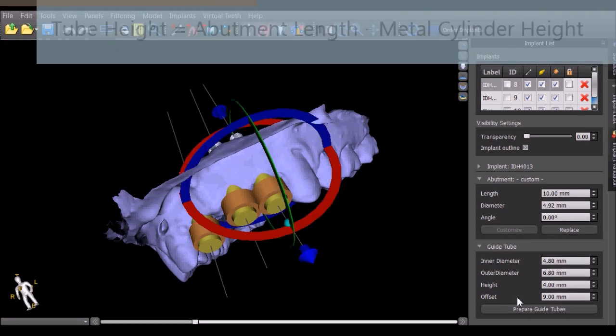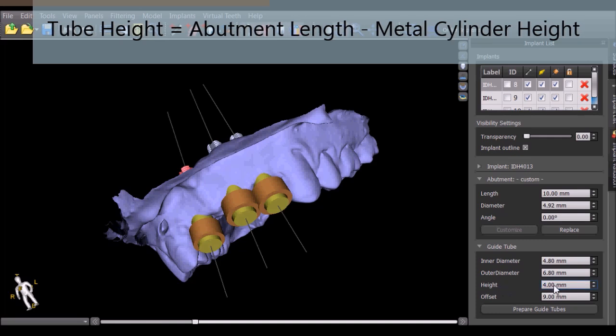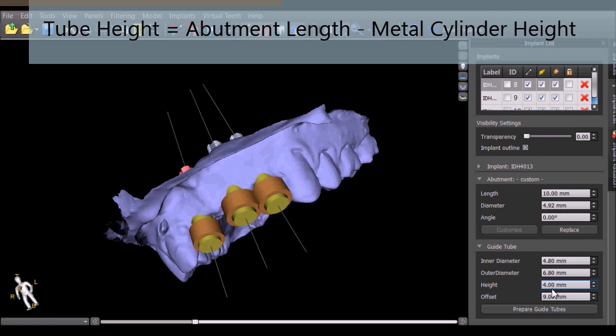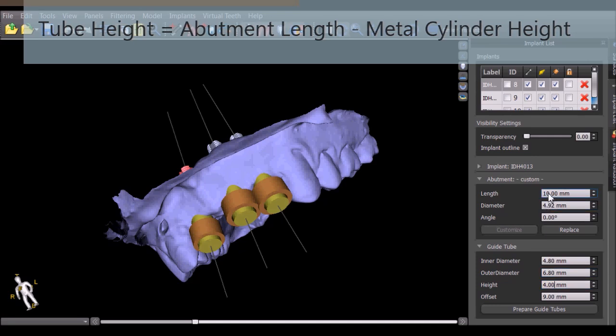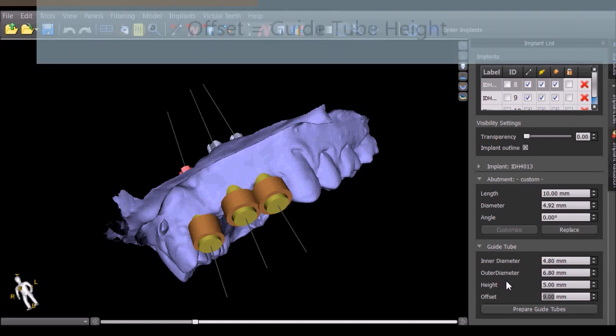The height of the guide tube should be set to the length of the abutment minus the physical height of the metal cylinder itself. In this situation, if we're using a 5 millimeter metal cylinder and the length of the abutment is 10 millimeters, then the height should be 5 millimeters. The offset of the guide tube should be set to the height of the guide tube so that the guide tube starts at the top of the implant.